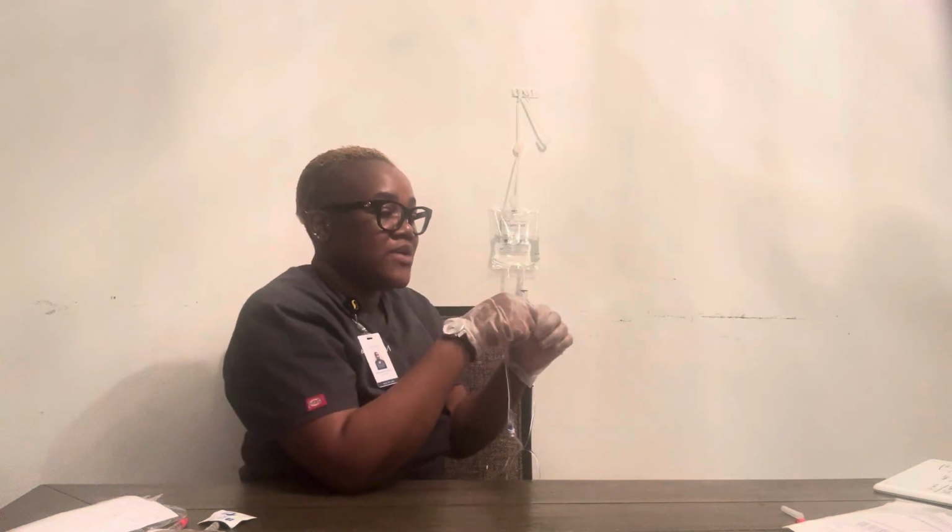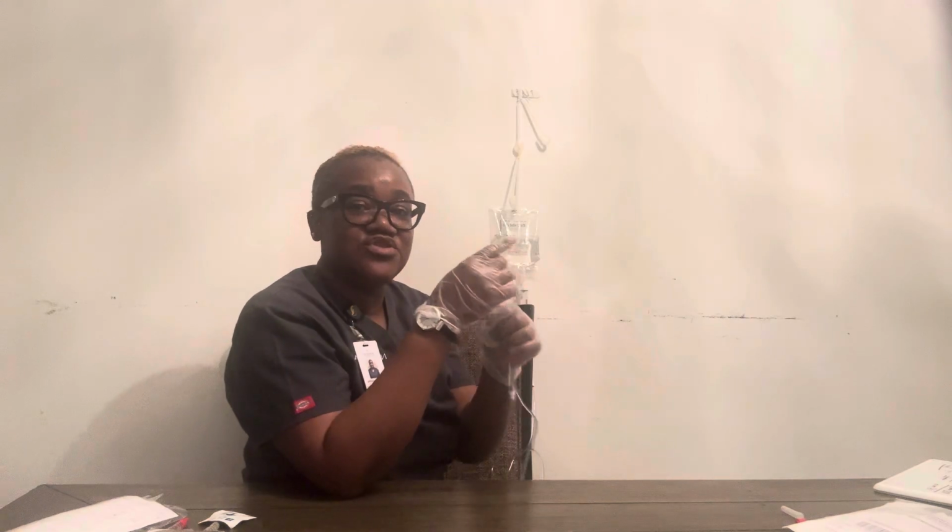And normally we would use the alcohol wipes, and normally I would clean the IV site of the patient, and then I would allow it to dry, and then I would attach my adapter end, and the infusion would continue. But I don't want to waste my supply, so I'm going to turn this off.